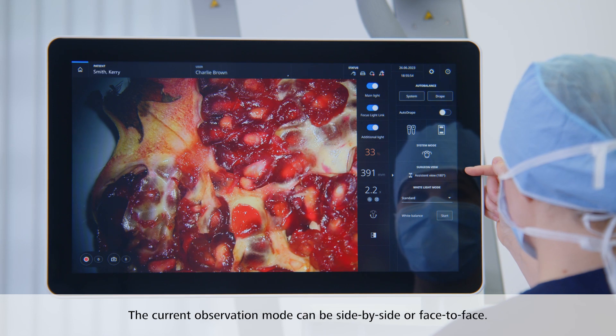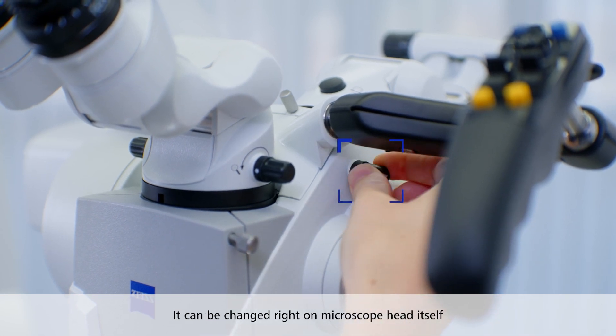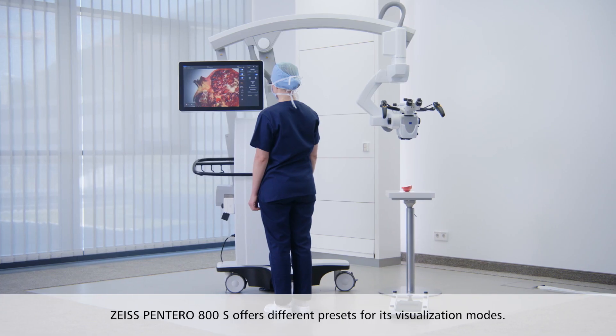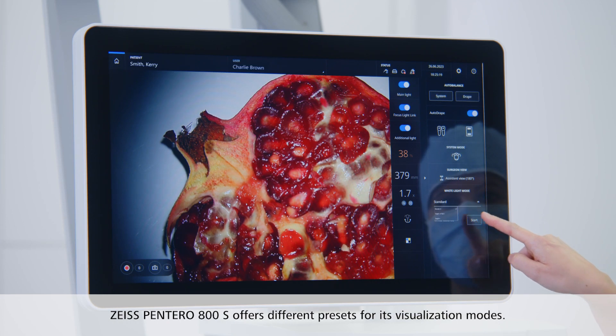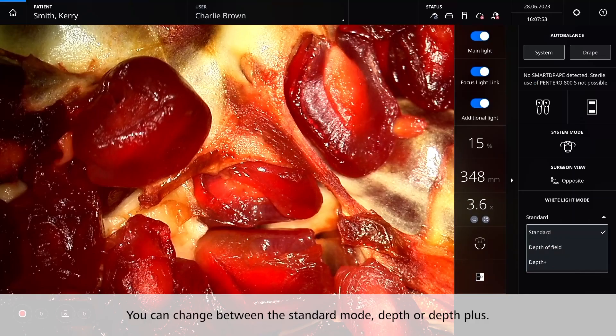Here you will also see the current observation mode — it can be side by side or face to face. The mode can be changed right on the microscope head itself by turning the little black wheel with the arrow. The Zeiss Pentero 800S also offers different presets for its visualization modes. Depending on your requirements, you can easily change between the standard mode, depth, or depth plus for an increased depth of field.